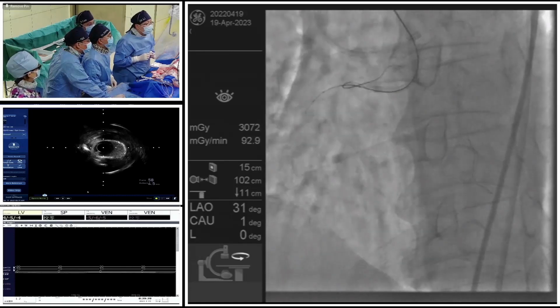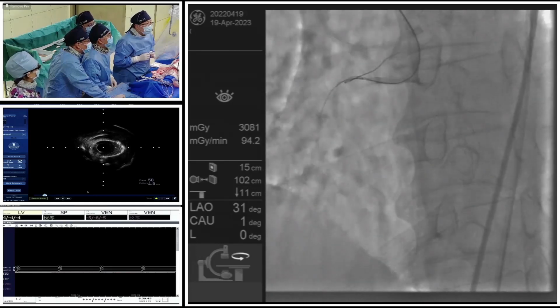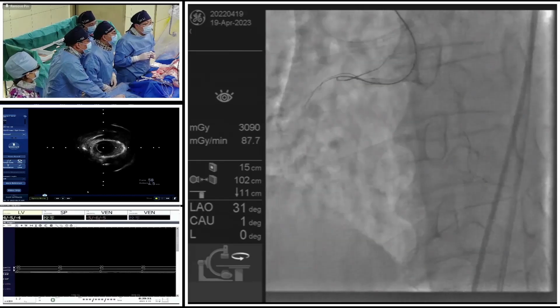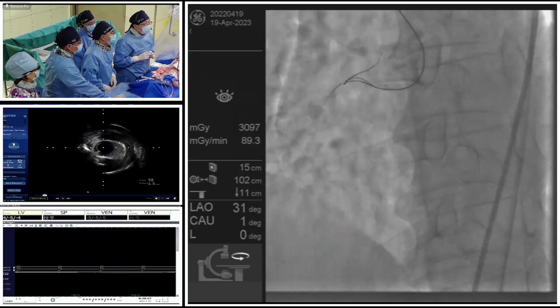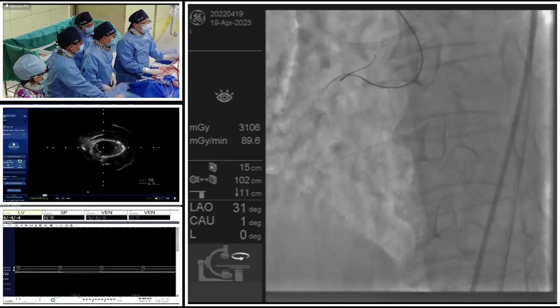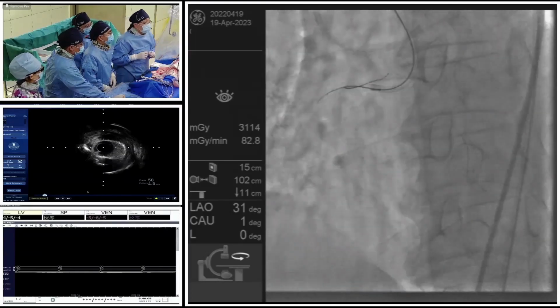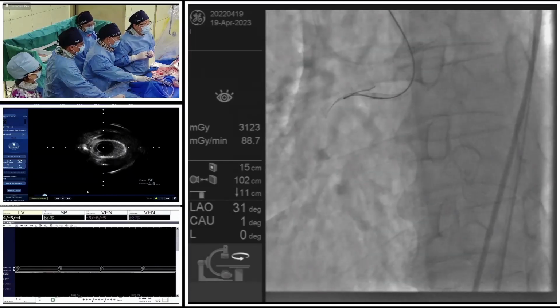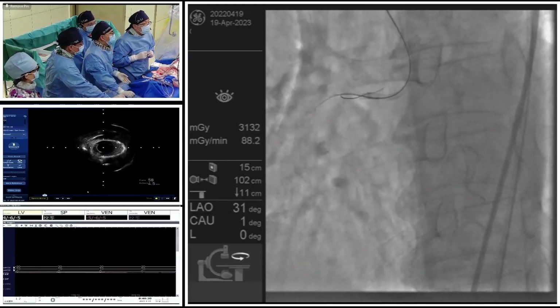This kind of value could improve a little, because we understand drug-eluting balloons could cause the plaque to shrink in the future follow-up. Although there are not yet strong, big studies for DCB use in de novo lesions, we noticed several clinical studies of 50 to 100 cases indicating that with proper plaque modification, the DCB could be applied to de novo lesions, especially for long diffuse high-risk patients. I think this is a potential benefit and strategy for this kind of patient.